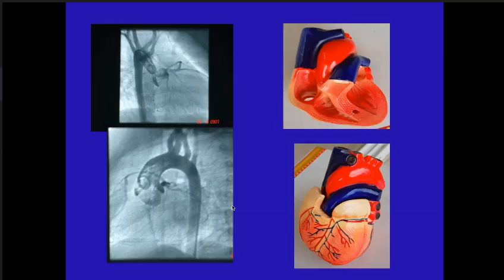Okay. Now, remember I asked you the lie of the coronary artery later. So this is very important. Can you describe these two angios for me? Yes, sir. The first one is the AP, sir. Plain AP. Sir, you are asking for the view only, or complete? Yeah, everything. Come on, man. When I show you an angio, I want the view, I want a description of the angio, I want the diagnosis, everything.